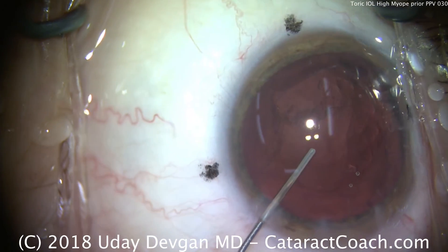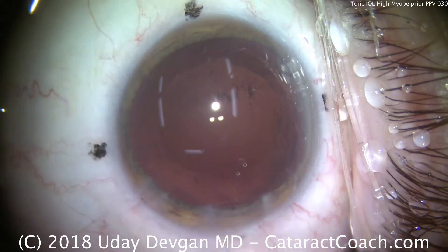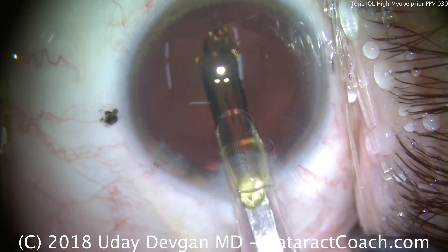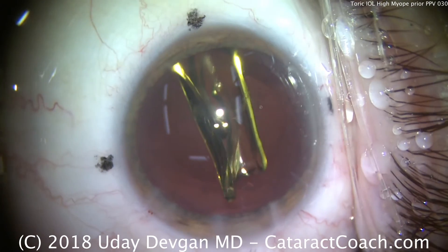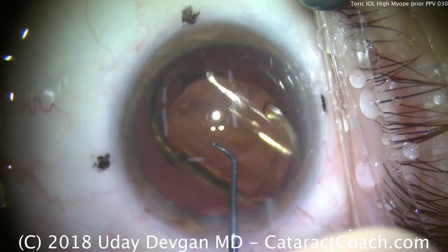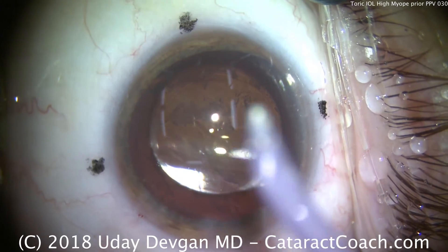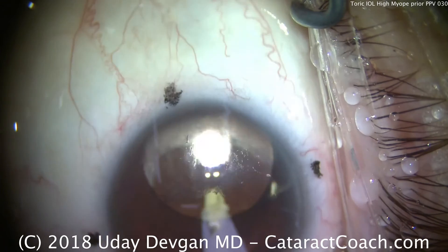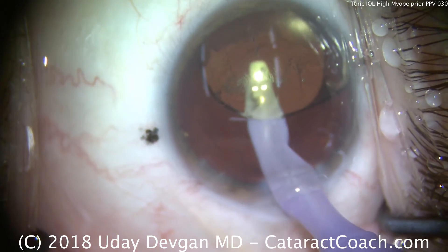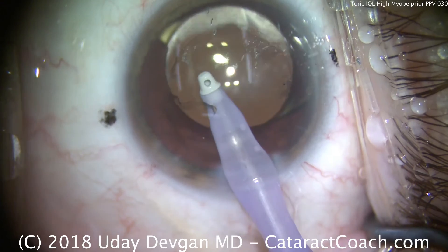The capsular bag looks nice and clean. We put some viscoelastic in — some of those opacities seen are trapped in the viscoelastic and will be removed when we take it out at the end. The toric lens has been loaded up into the injector and is delivered within the capsular bag. We know our steep axis is 180 degrees. The toric power is lined up at the haptic-optic junction, and we rotate the lens so it can be dialed clockwise — this Torque lens is best dialed clockwise. Going under the IOL, it's a critical step to remove viscoelastic. Do not leave viscoelastic behind the IOL, as it will increase lubricity, decrease friction, and allow the lens to slip.